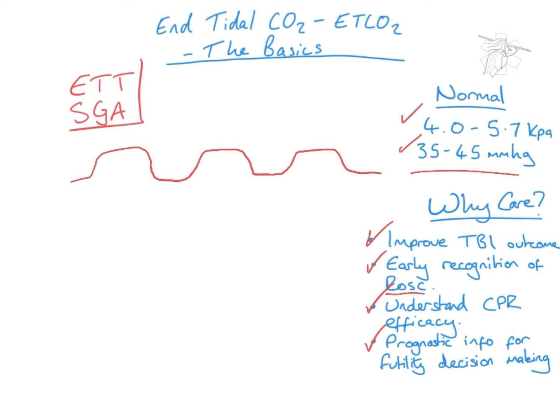And each one of these represents the ventilation of a patient. So if they're breathing spontaneously, it's the breath in and out, or if we're ventilating them, it's telling us the way that we are ventilating them, and the efficacy of that really.